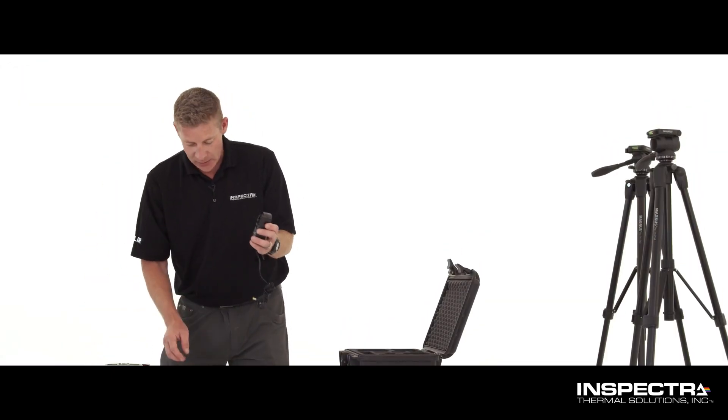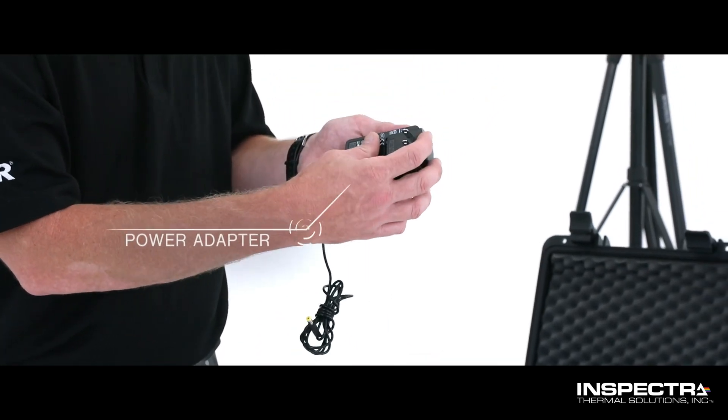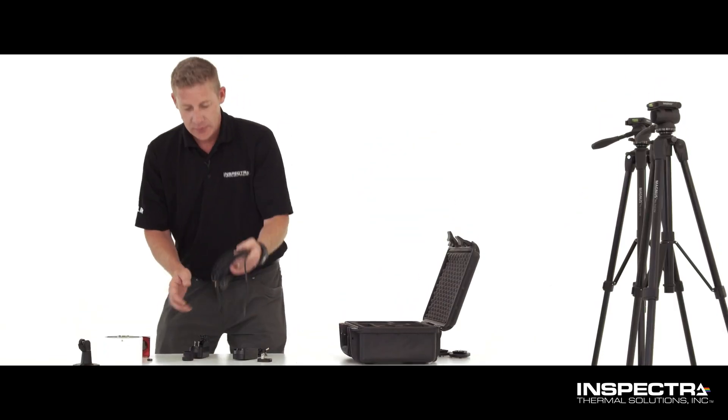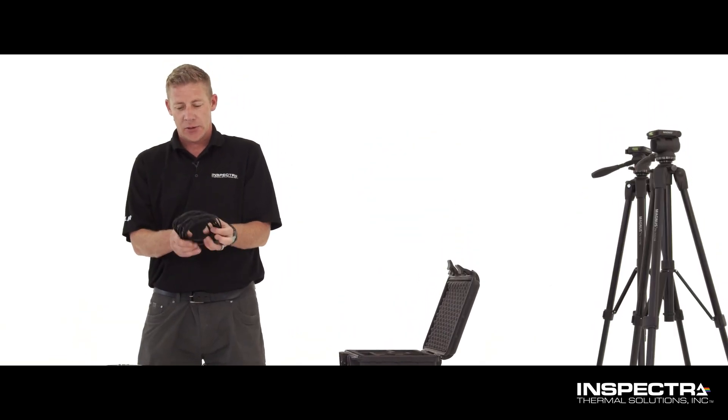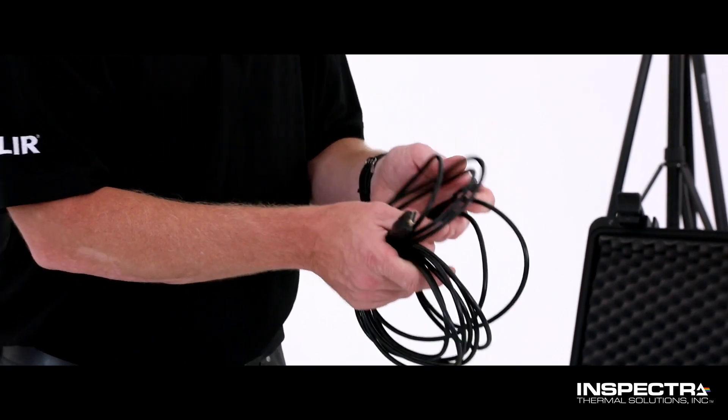We have our AC power supplies with the USA adapter. If you're in another country, it will include the adapter for your power system. We also have our HDMI cable, which is full-size HDMI to your screen and micro HDMI to the camera.